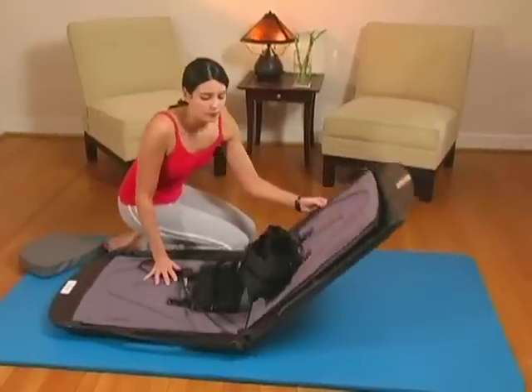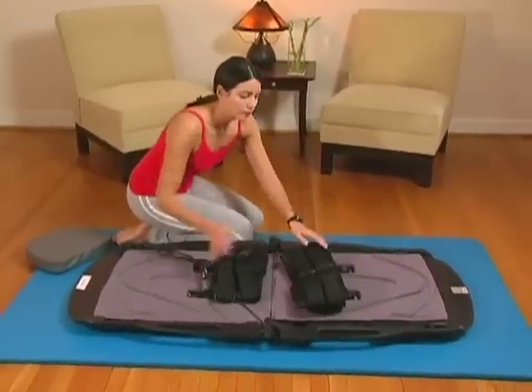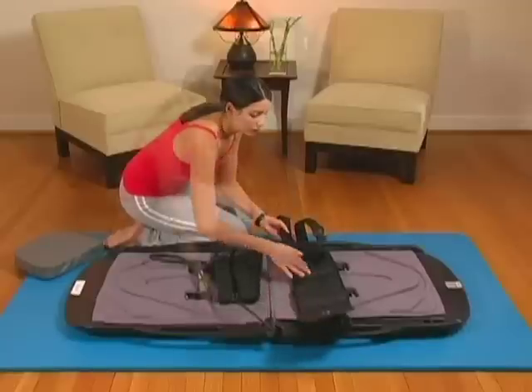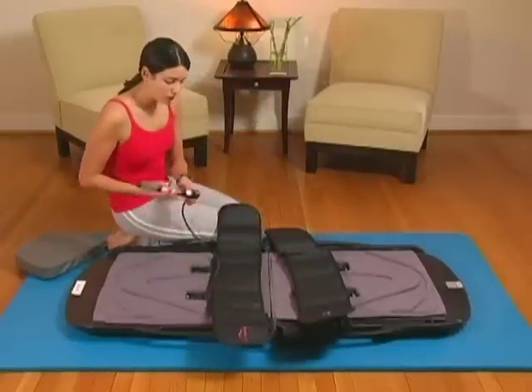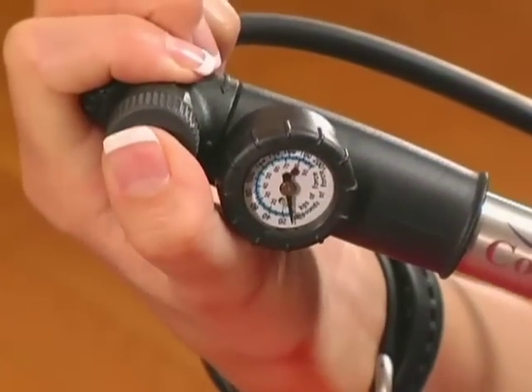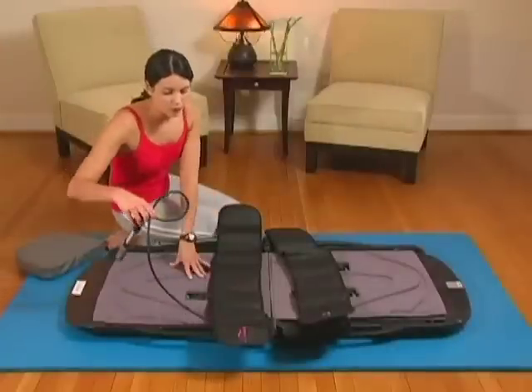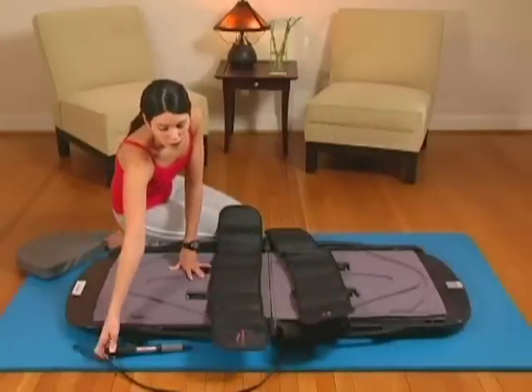Open the device as you would a briefcase. Open the adjustable belts out to the side of the unit. Depress the release button on the pump to ensure that traction is in the neutral position. Next, make sure the hose is clear of the unit and that the pump is easily accessible once lying down.